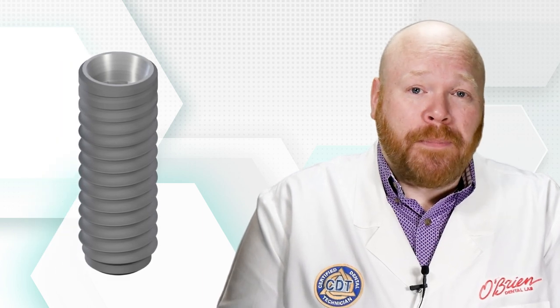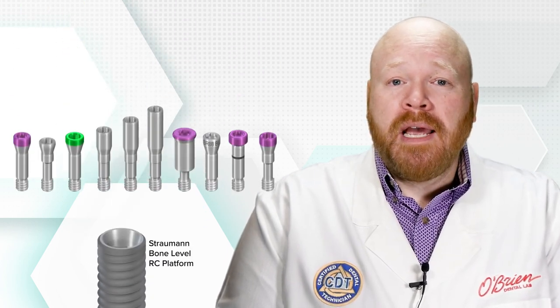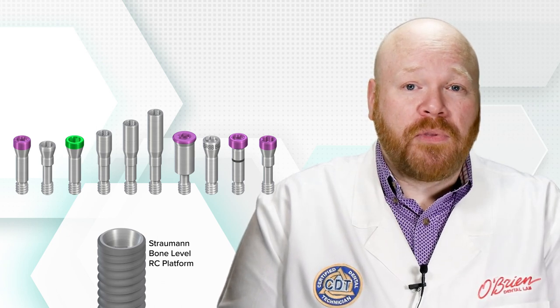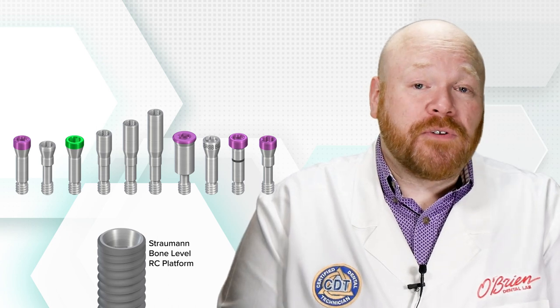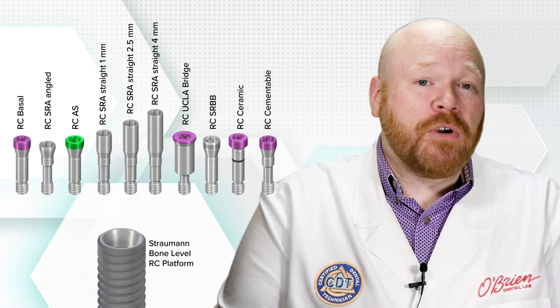Let's look at the Straumann bone level implant as an example. If we focus on the RC platform and just look at screws sold by Straumann, there are 10 different options. Even though all 10 of those screws share the same thread form and will therefore thread into an RC implant, they have very different designs, and each of those designs was engineered to work with their specific abutment counterpart.